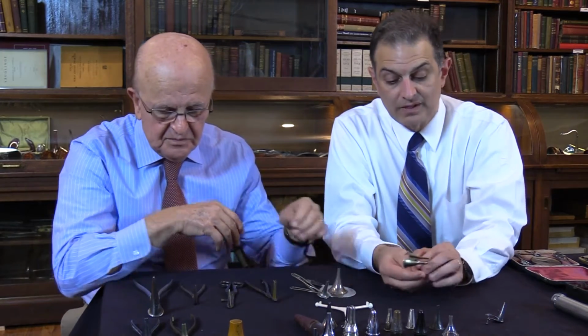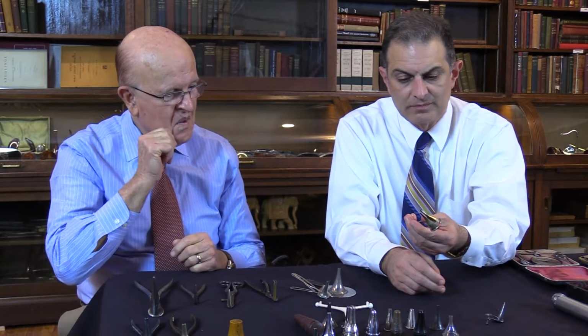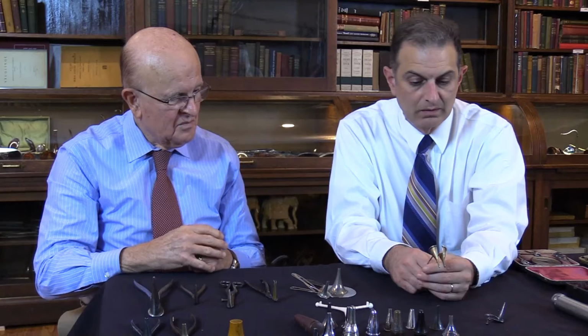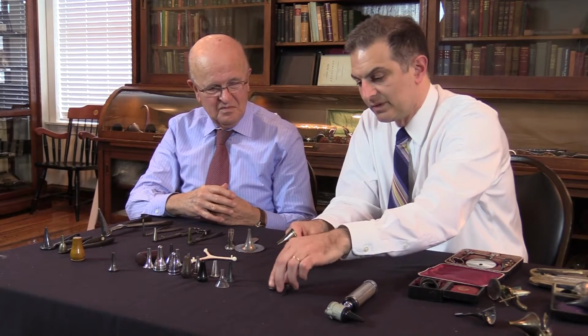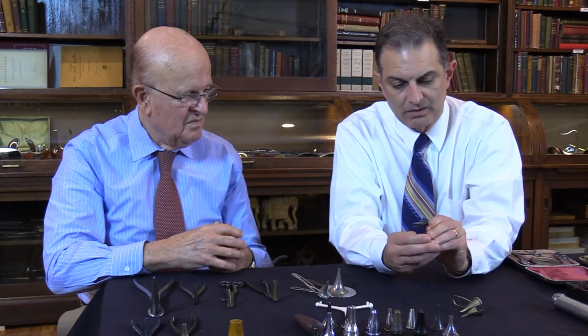And they also came up with a really interesting speculum in order to expand the canal some. So instead of just wedging a larger speculum, this one was adjustable to some degree, and you can pinch it or leave it relaxed as much as you need to expand the canal. As we know, the membranous canal is fairly pliable, and so it probably served a nice purpose to get in the canal, to clean the ear. And they even had some smaller ones with a similar idea, almost like a bird's beak or a duck bill.